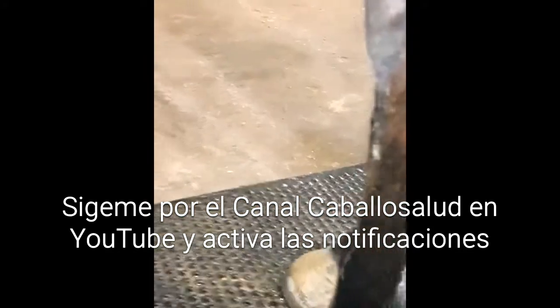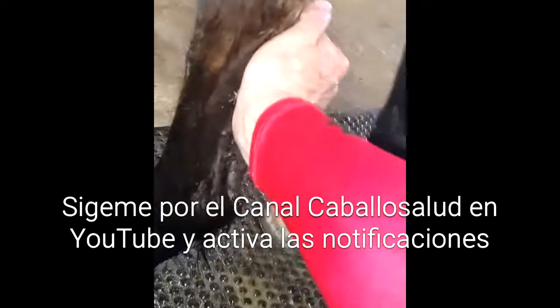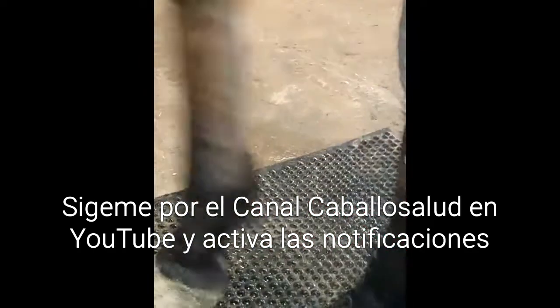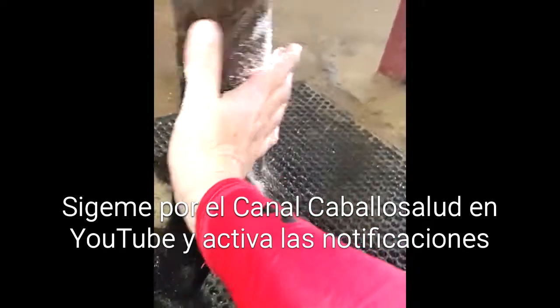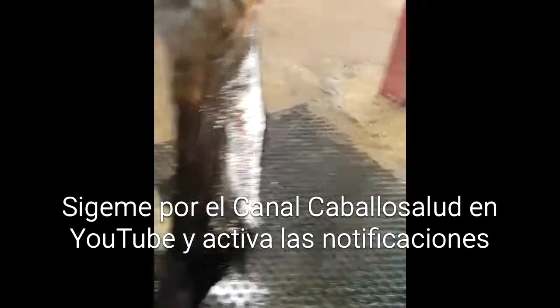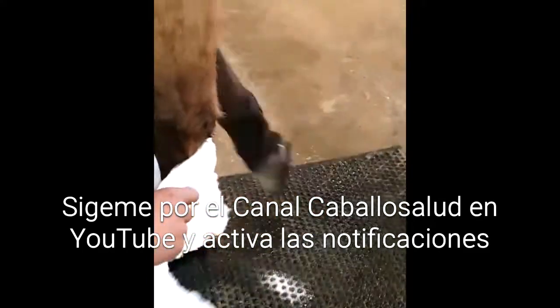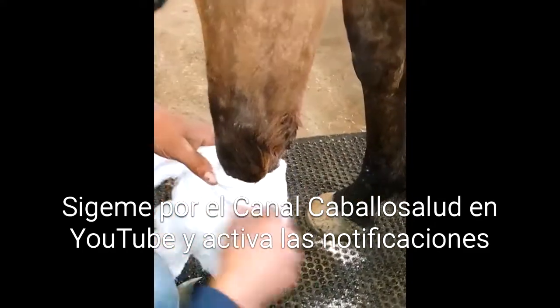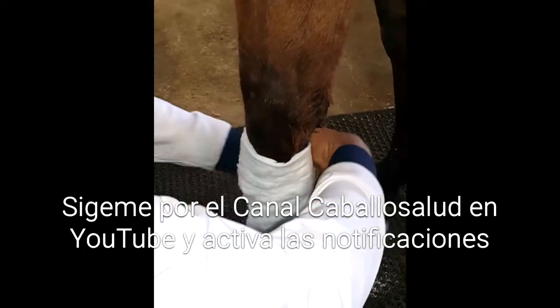Justamente donde puse la inyección de plasma. Le tengo miedo, para qué decir mentira. Se pone azúcar en la mano, y ahora el vendaje — primero algodón.